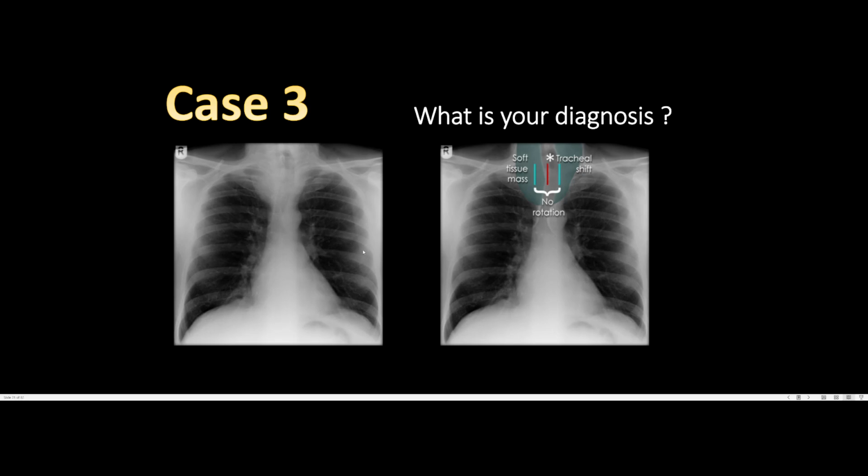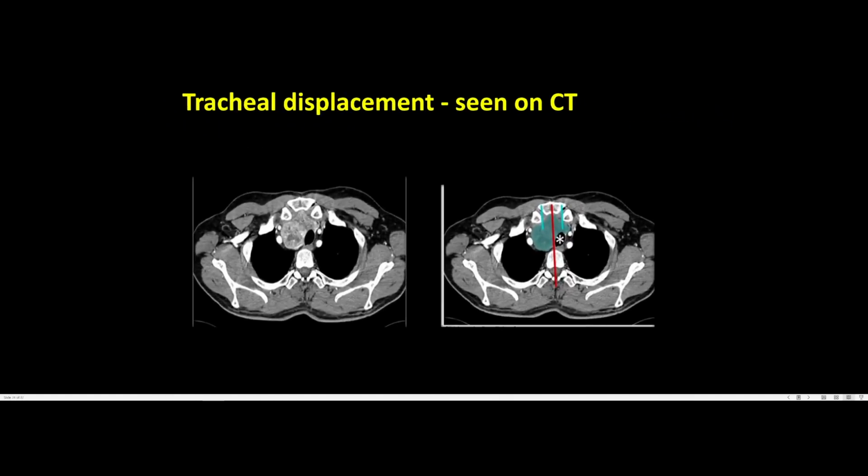And this is very obvious, even without a chest X-ray, especially if you clinically percuss over the sternum or the manubrium sterni and there's dullness, that suggests retrosternal goiter, which by the way is one of the many differential diagnoses, as we could say even on the CT scan of the same patient, of anterior mediastinal masses.